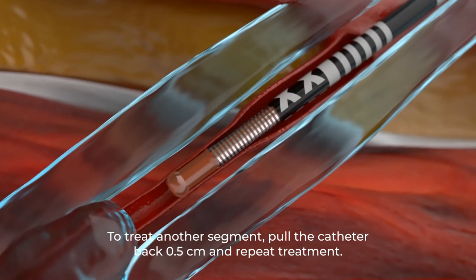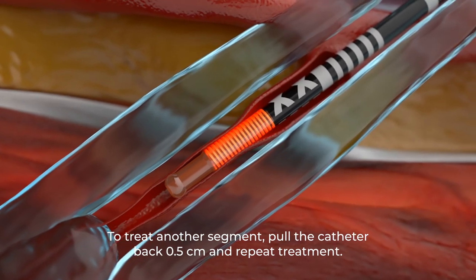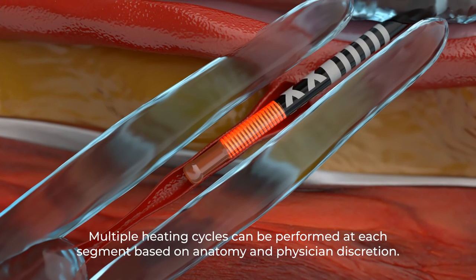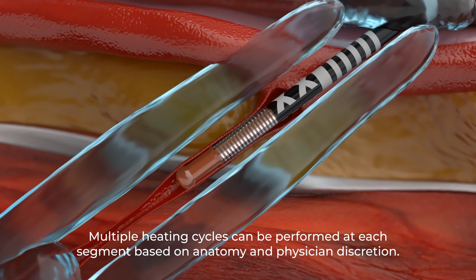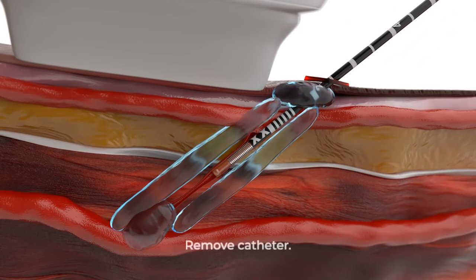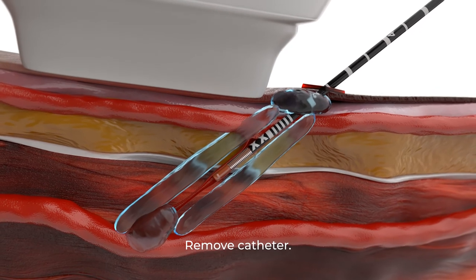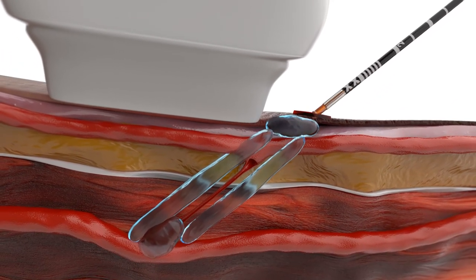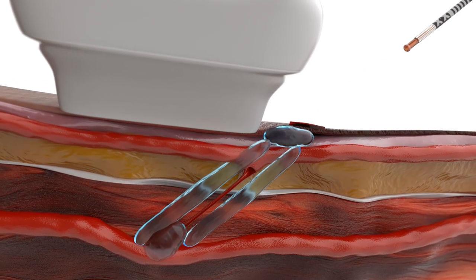If multiple treatment segments are planned, pull the catheter back 0.5 centimeters and repeat treatment. Once treatment is complete, remove the catheter, confirm occlusion of treated vein, and confirm patency of deep veins with ultrasound. Apply external compression.